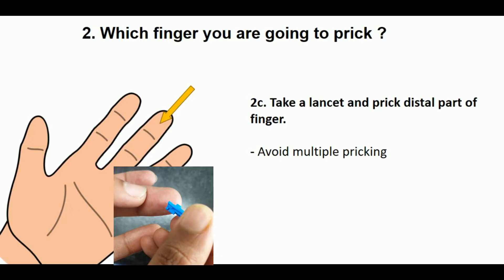Take a lancet and prick the distal part of the finger. Only a single prick — avoid multiple pricking.